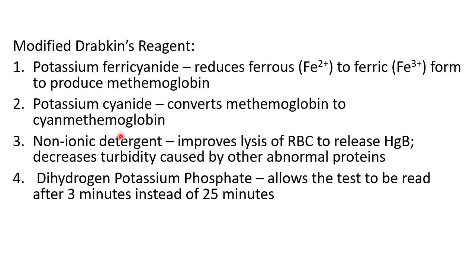So, meron na tayong modified Drabkin's reagent, no, to intensify or para ma-improve yung technique. So, ang ina-add dito sa modified Drabkin's reagent, yung number 3 and 4. Non-ionic detergent, ito naman, it improves the lysis of RBC. Therefore, mas mabilis yung release of hemoglobin. Okay? And other advantage nito, it decreases the turbidity caused by the proteins present in the plasma.